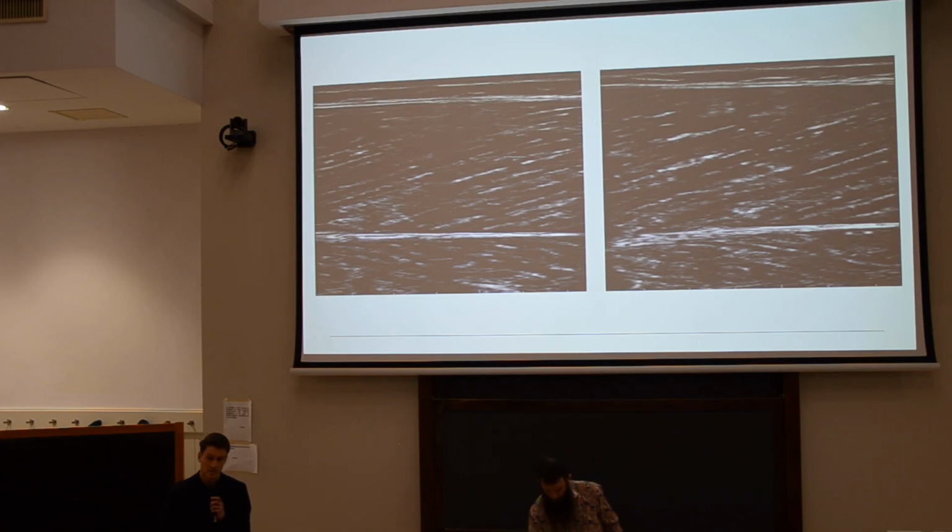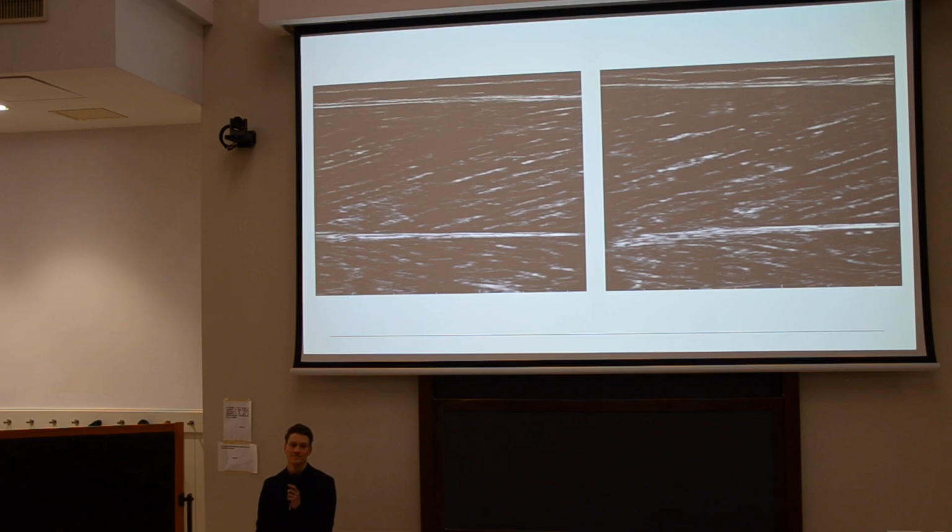Let's start by looking at these two images. And I want to do a quick exercise. Show of hands. Who thinks that these two images are captured from the same participant? Okay. So not too many hands raised, but those of you that did have very good eyes. They are, in fact, the vastus lateralis, so it's the same participant, a week apart, no intervention.